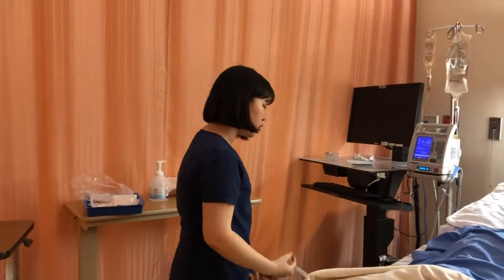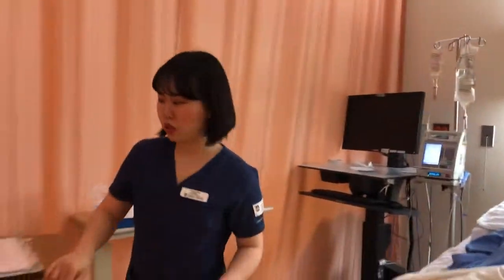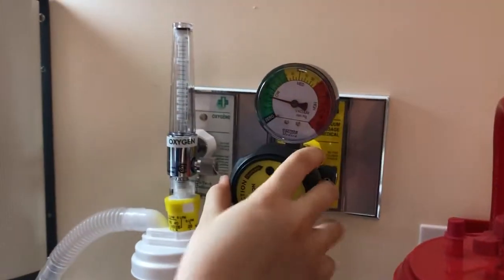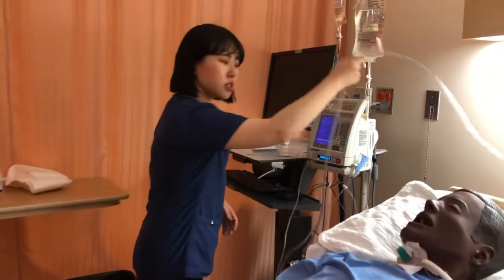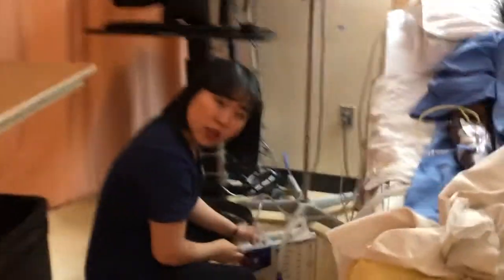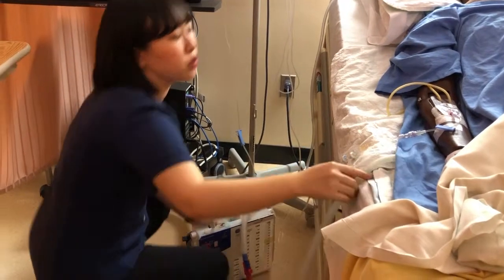So for the chest tube, checking the patient in a central position, and then I'm going to check the suction here. The tubing is connected, and the integrity of this tube, and it's going to remain at the low level. The reason why you're getting a chest tube is because you have a hemothorax. It's maintained below the level of the patient's chest tube insertion site.